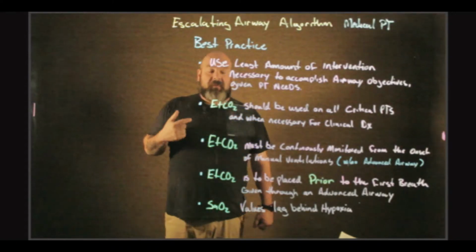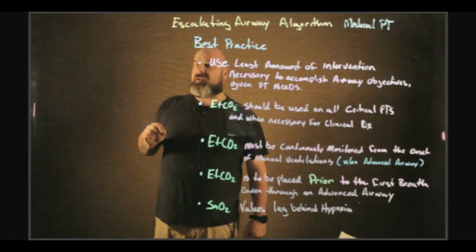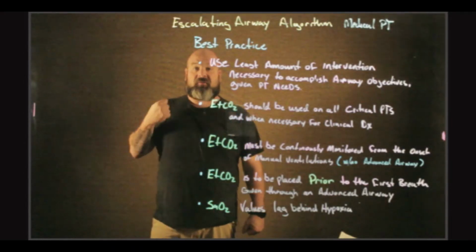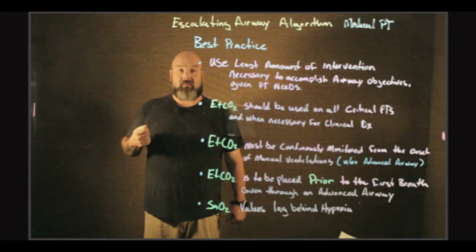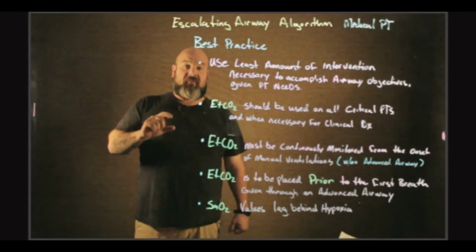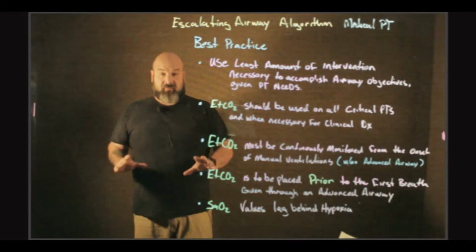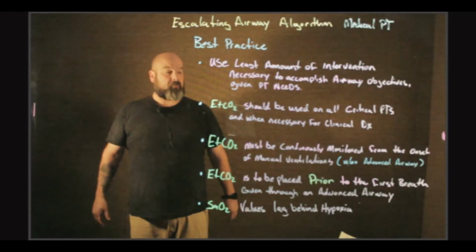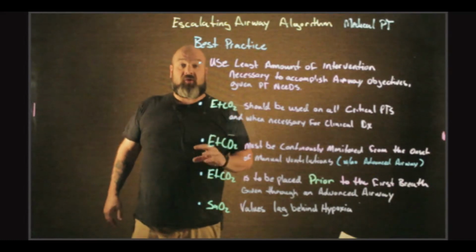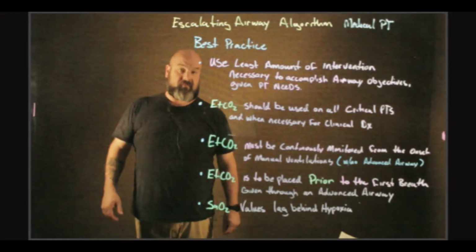End-tidal CO2 must be continuously monitored from the onset of manual ventilations with or without an advanced airway. So if you have to breathe for this patient, if you're using the bag mask ventilations, from the very first breath, you should have the side stream attachment attached to that bag mask from the first squeeze of the bag, with or without an advanced airway, meaning whether they're intubated or not, you should have end-tidal CO2. It will work with a bag mask setup.